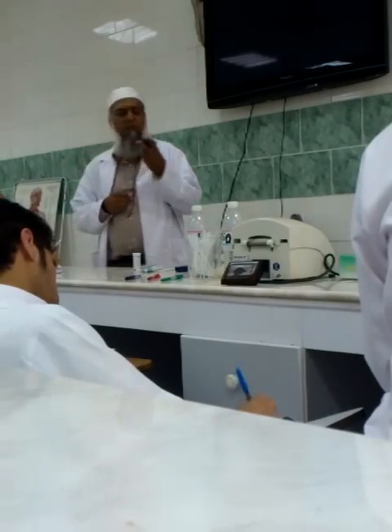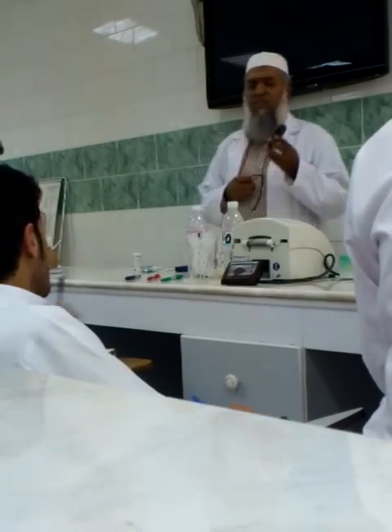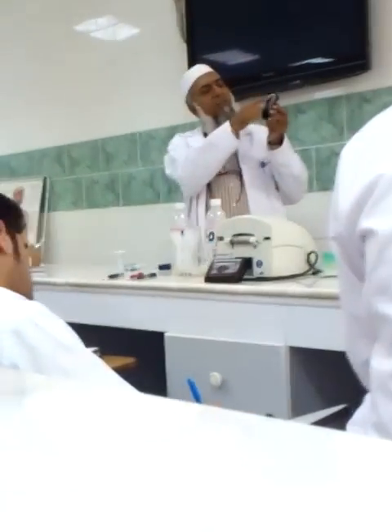This glucometer has some parts. The first part is a screen to show the different values: value of glucose, number of the coding chip, level of the glucose. All these are represented on the screen. Number two, a second part is here, a small space or cavity or opening.